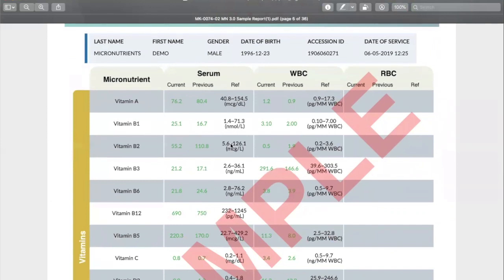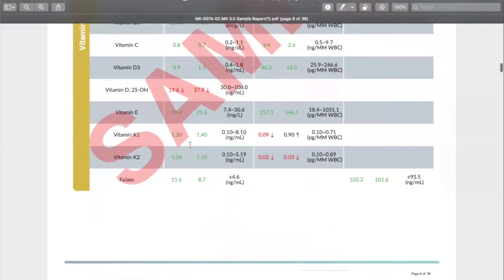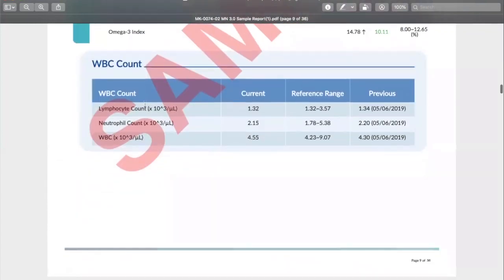Next we get to the actual values. For everything tested — not just the things that were abnormal — we give you the actual values for the intra- and extracellular levels. If this is not the first time you've run this test on the same patient, you're also going to see their previous values, which is a nice way of looking at patterns. We also give you the white blood cell count so you can interpret the intracellular values in the context of that person's white blood cells.